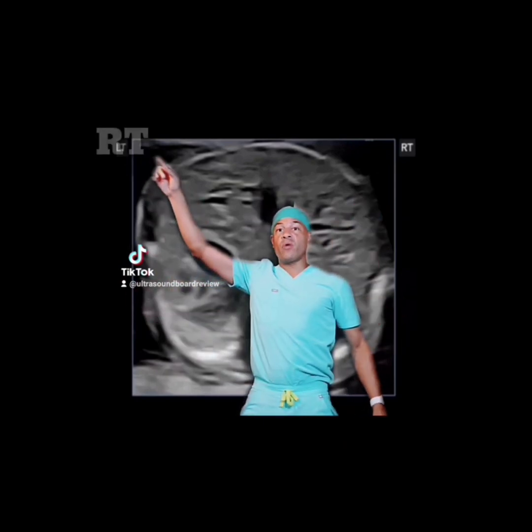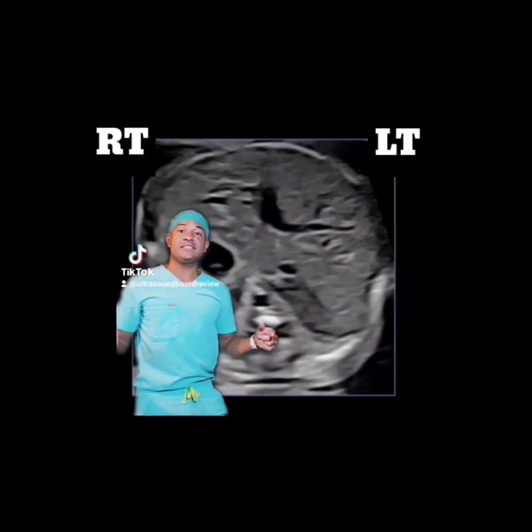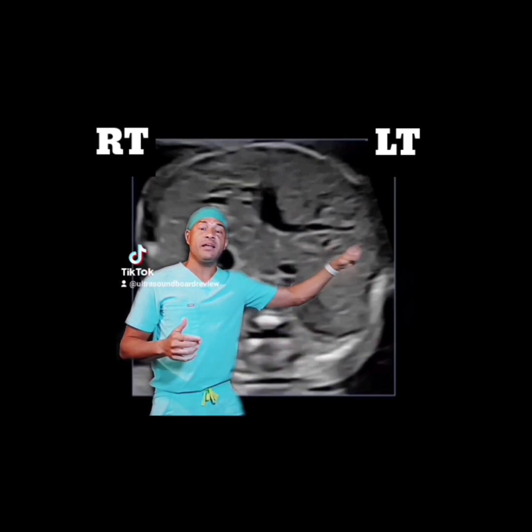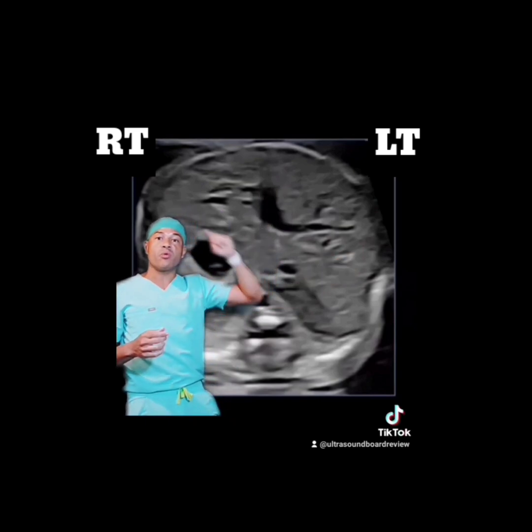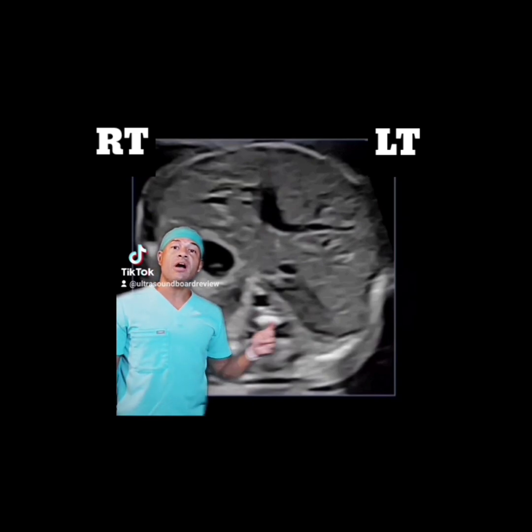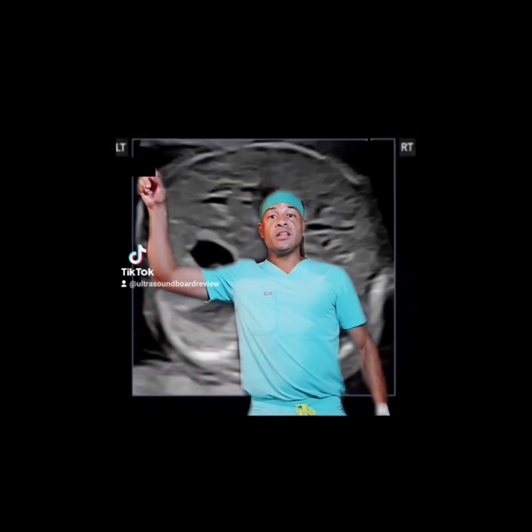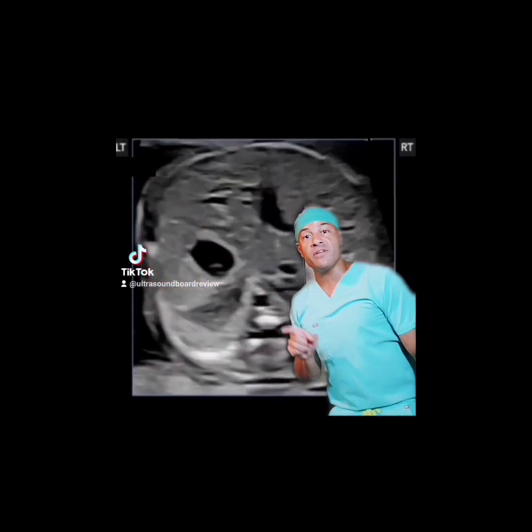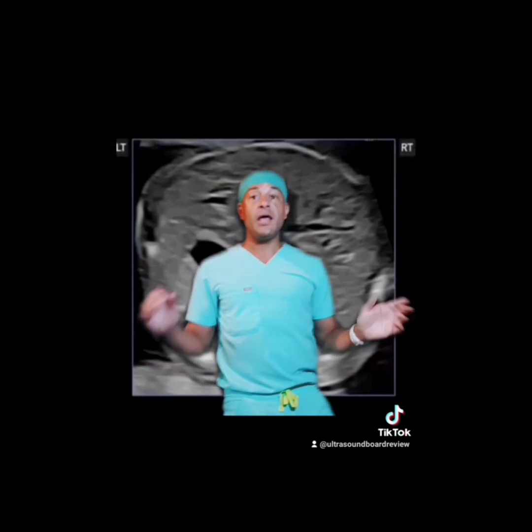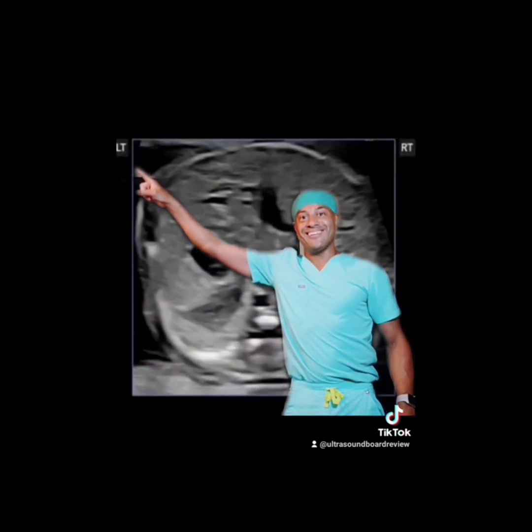This can't be a breech based solely on the spine's position and the left and right markers. If this were a breech, with the right side here and the left side there, and the spine in the same position with the fetus still on its back, you would have the stomach on the opposite side, the portal sinus L-shaped toward the right, IVC on the right, and the aorta on the left. This can't be a breech presentation even with situs inversus, because the stomach is labeled on the left side.